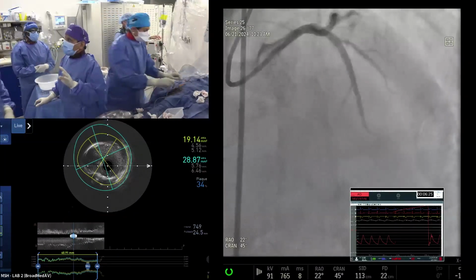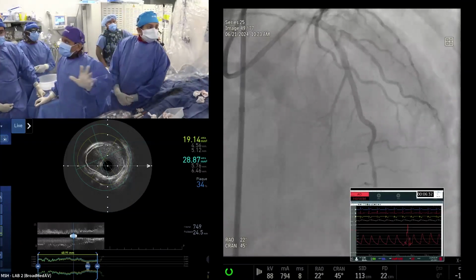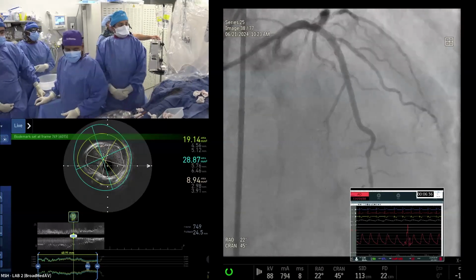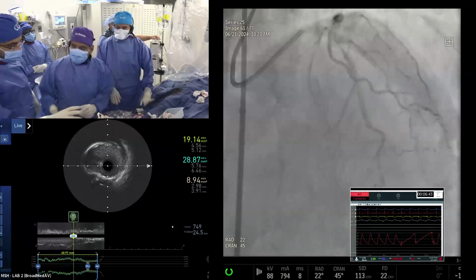Remember, you also did it with the drug-coated balloon. The whole idea was no IVUS and no post-dilatation if possible, unless there is little osteal disease. I mean, we'll give a little nitro and verapamil. That will take care of it. If everybody is okay, we are done here, and we can start your lecture series.